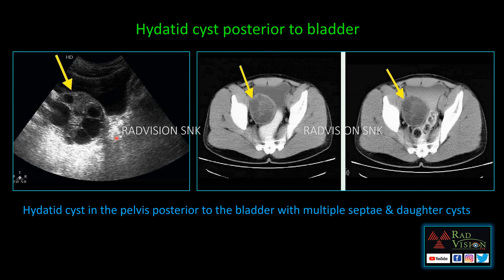Next, this is also hydatidosis. You can see there is a large hydatid cyst with multiple daughter cysts posterior to the bladder on the right side. On CT with IV contrast, you can see this cystic lesion with multiple daughter cysts posterior to the bladder.